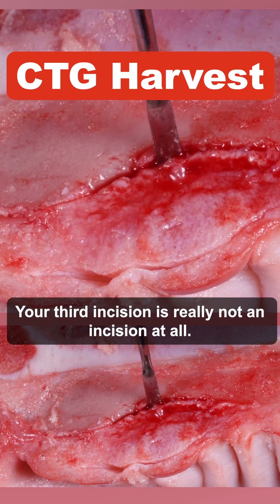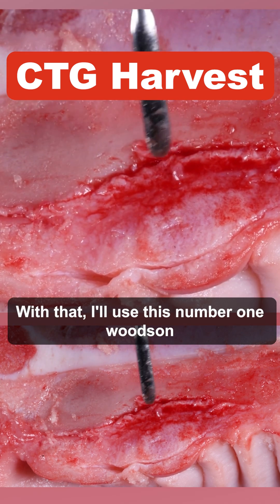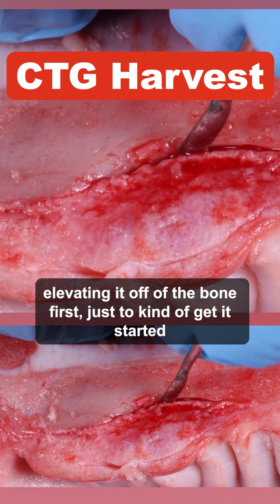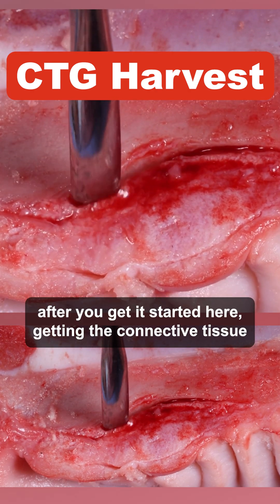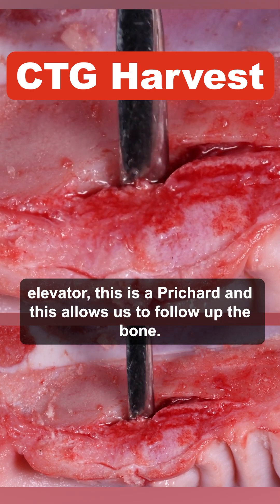Your third incision is really not an incision at all — we'll actually blunt dissect the connective tissue right off the bone. I'll use a number one Woodson, or whatever your favorite instrument is. I'll take a smaller one and just start elevating it off the bone first to get it started. Then I'll go to a bigger periosteal elevator — this is a Pritchard — and this allows us to follow up the bone.